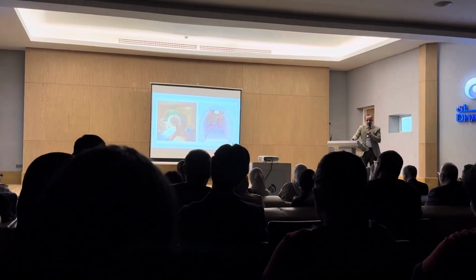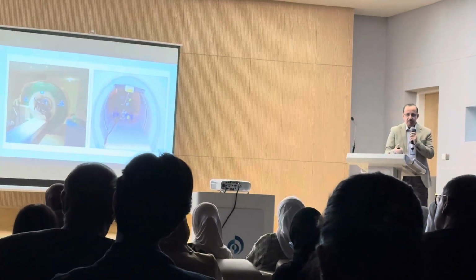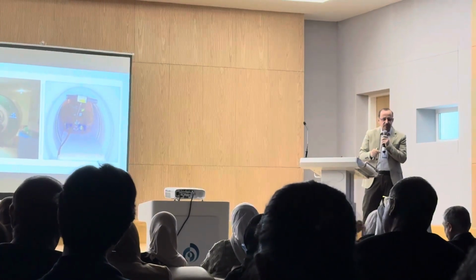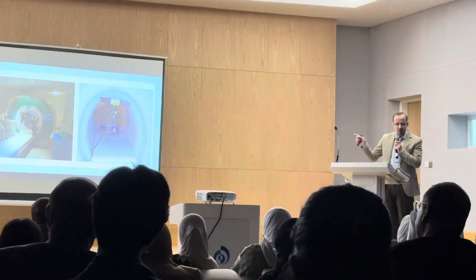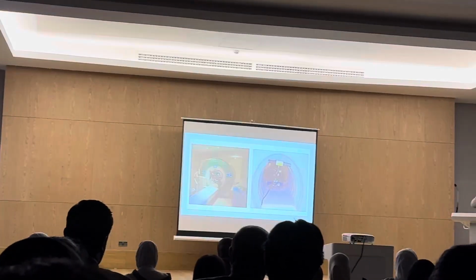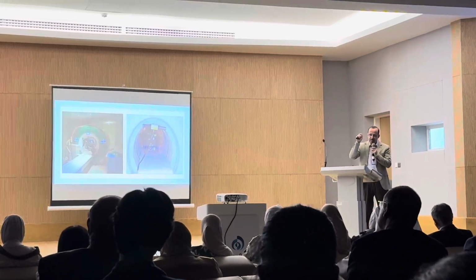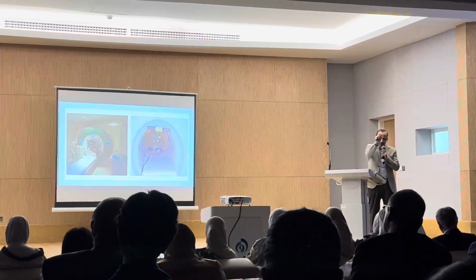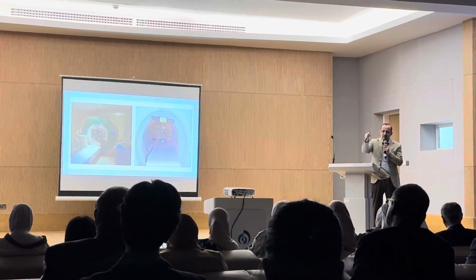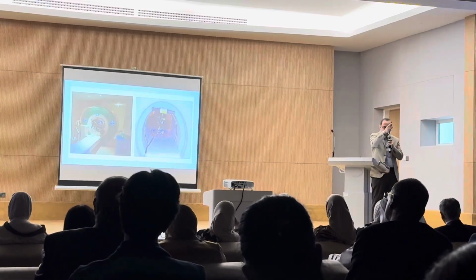What I mean is that all these items that I mentioned here are always present and available in the atmosphere and environment of MRI. So it can happen if we don't follow the safety guidelines and parameters. I witnessed one of these accidents in my previous work, luckily it was a small oxygen cylinder, and you can't imagine the speed that this metal went into the bore. Luckily, we were at the early stage of the imaging, and by mistake the staff approached deeper into the unit, and it went like a missile into the bore.